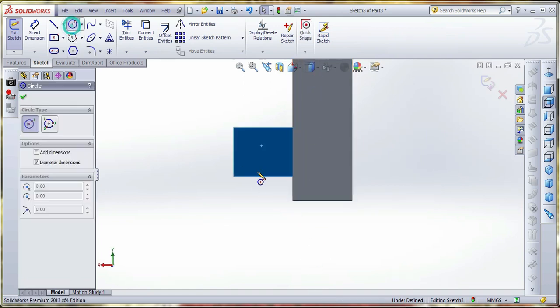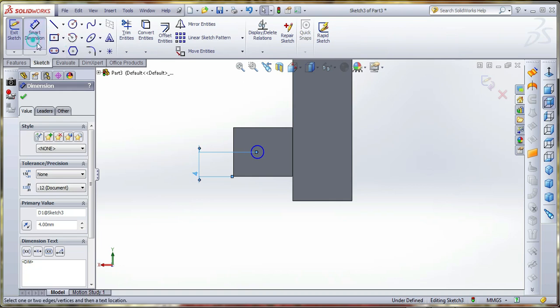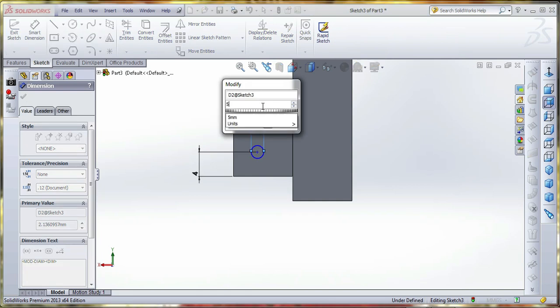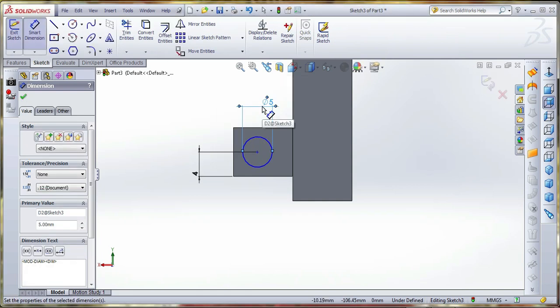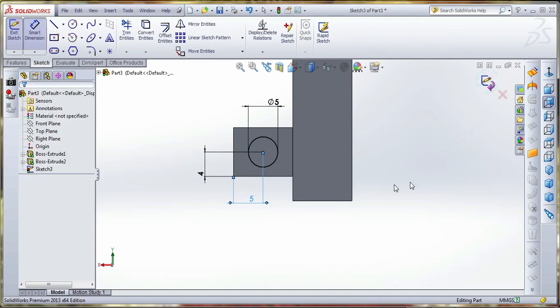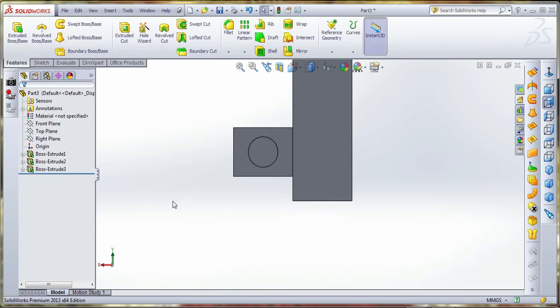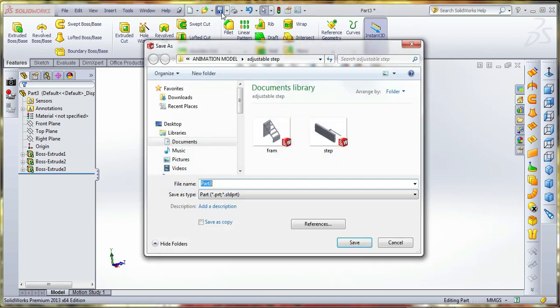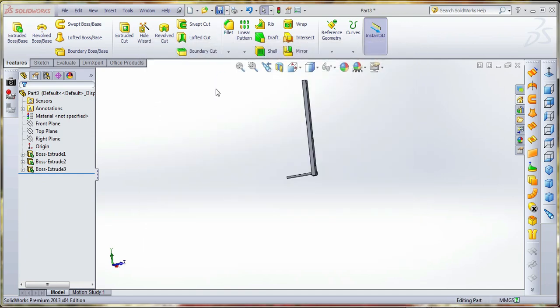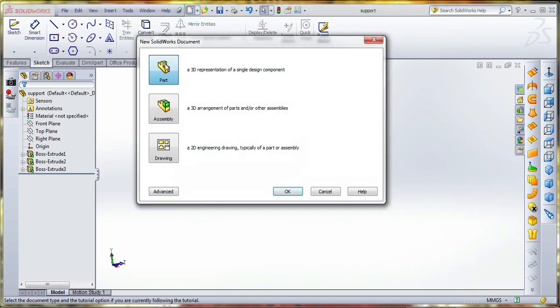So we draw another pin. Five. Okay, going to extrude. This is 80. 80. Okay, draw the next one.